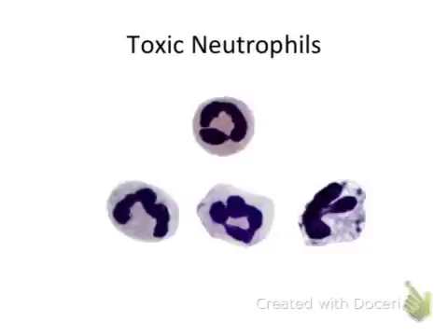It means that the neutrophils have undergone a shortened maturation period due to either an increased demand for neutrophils or direct toxic injury to neutrophils, such as in sepsis. In either case, the most common cause of toxic neutrophils is inflammation.